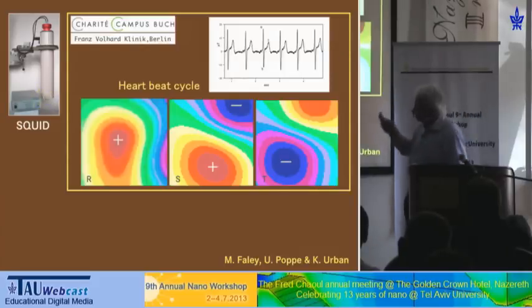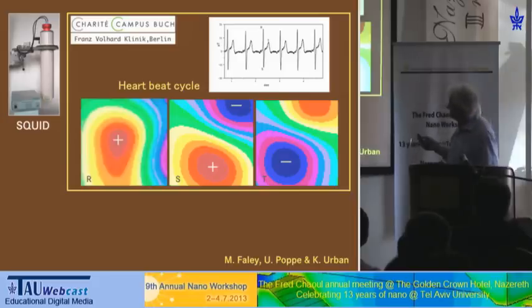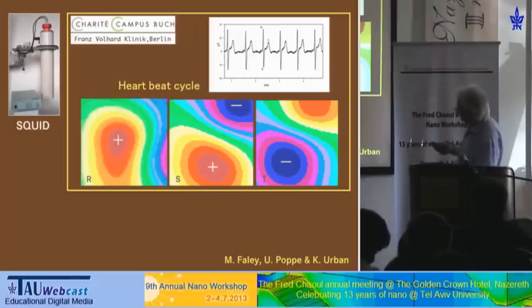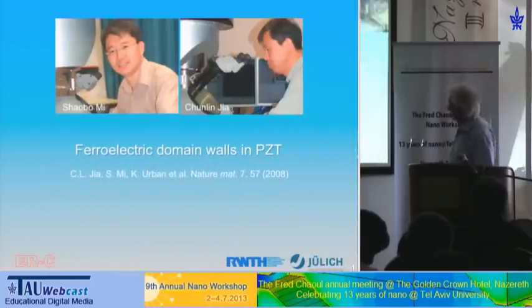Here we mount this sensor to a scanning device, and in collaboration with a clinic in Berlin specializing on heart problems, we now can measure the magnetic field above the heart at various phases of the heartbeat cycle.